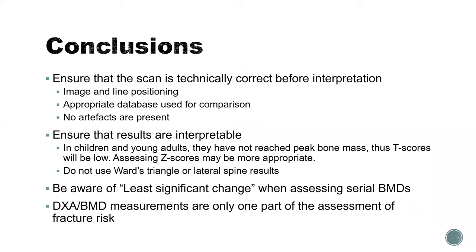So let me conclude by saying that these are the things I hope you've taken away from listening this afternoon. Ensure that the scan is technically correct before you interpret it. The image and the line positioning are especially important for the spine, but also for the hip, where the boxes are. Make sure that there's an appropriate database for comparison and that there are no artifacts present.